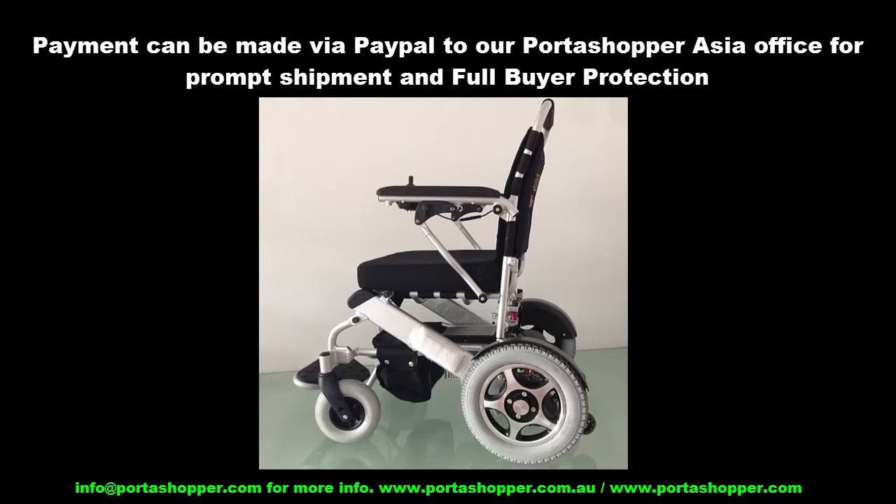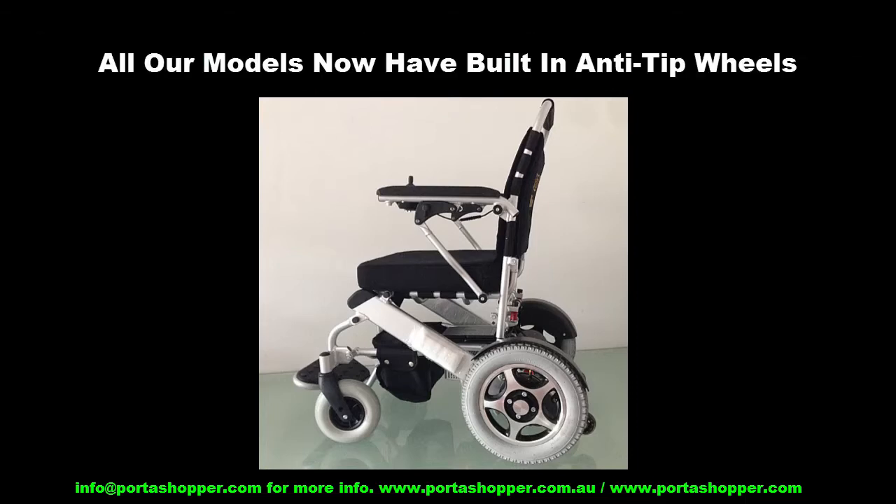Payment can also be made by PayPal to our PortaShopper Asia office, which ensures that all purchases are shipped without any delays. For those who want to get one of our heavy-duty models that can carry up to 150 kilograms, we've also redesigned them to include built-in folding anti-tip wheels.